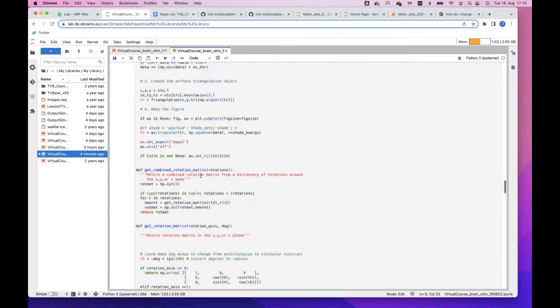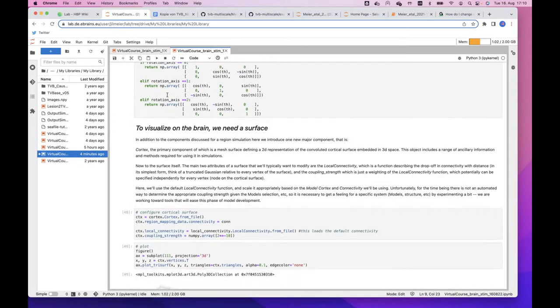And you can see here that at 1,500, first we have a transient, we always have that. And at 1,500, it starts to have some big outliers here, which is probably our region that is getting activated very strongly by this stimulus. All right, this is not looking too nice.